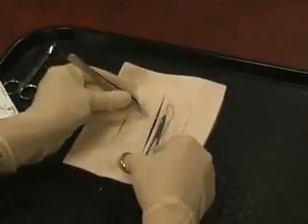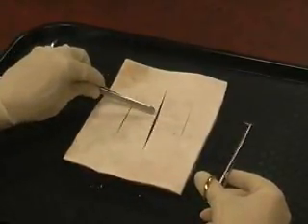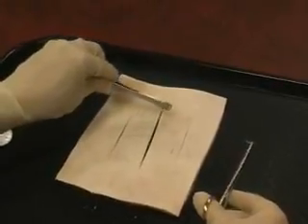Other people like to start in the center and do what's called the rule of halves. So the first suture would be placed halfway through the wound, and then we would half that by placing a suture here, and then we'd half the next segment. So one here, here, here, and basically the idea is you'll avoid an unevenness.